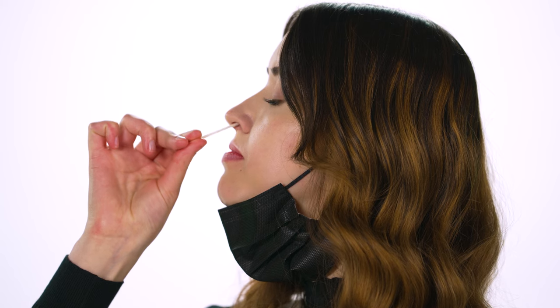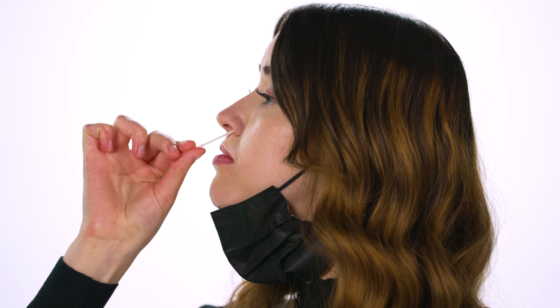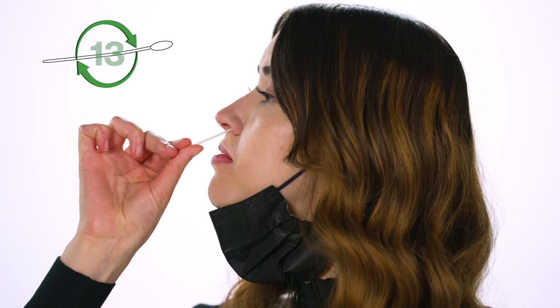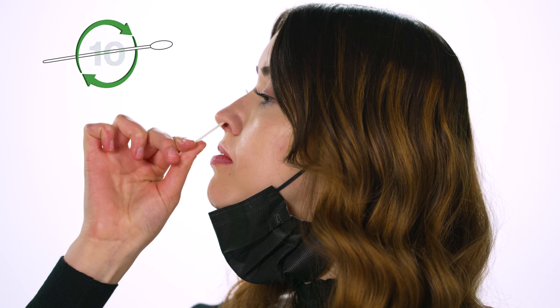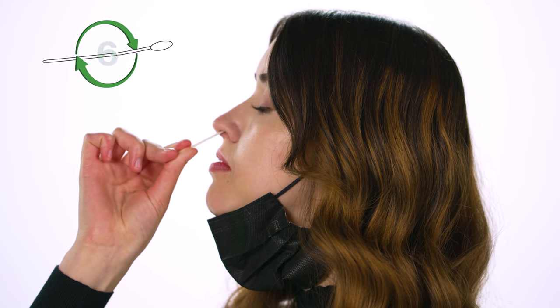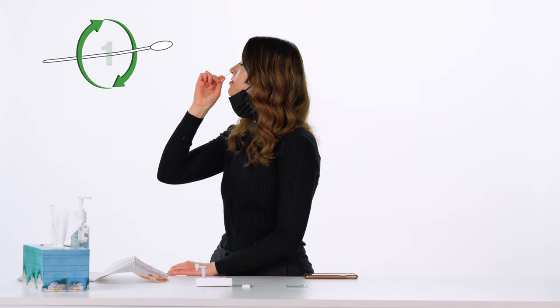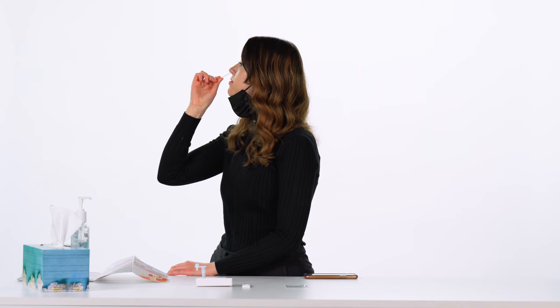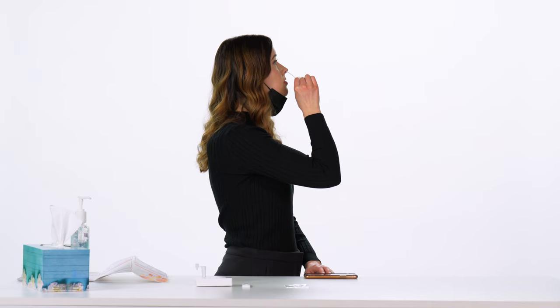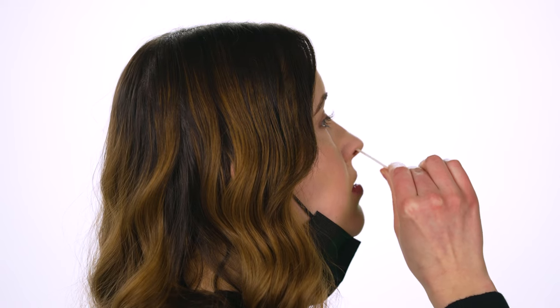Using a wide circular motion, roll and twist the swab against the inside of your nostril at least five times, making sure to swab all around your nasal cavity for at least 15 seconds. Pull the swab out while twisting and repeat in the other nostril using the same swab. When you are done swabbing, do not return the used swab to the packaging.